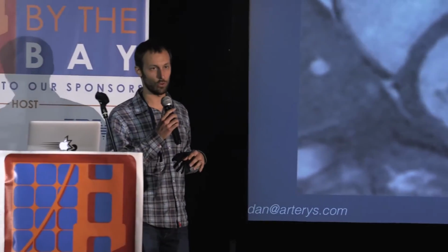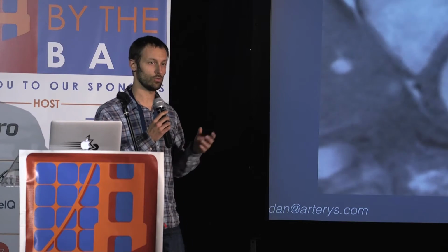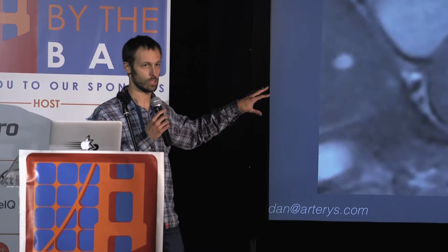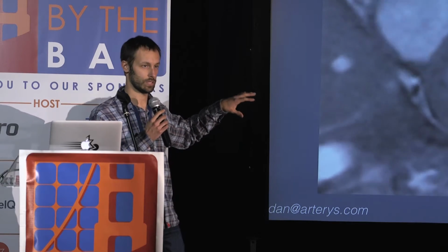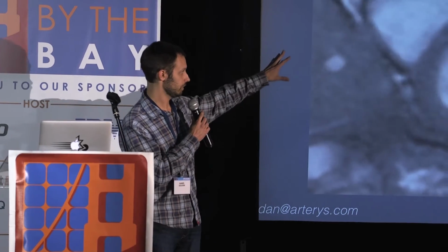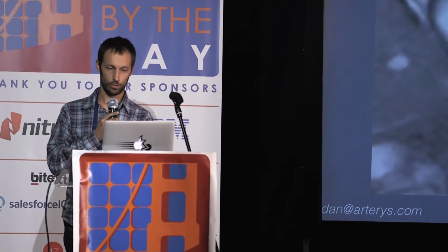And the reason this is important is because when measuring cardiac function, the radiologist will typically only segment and determine volumes at a maximum contraction and dilation. So the time points at which we have segmentations can be different for the left and right ventricles. And I'll explain why that's important next.